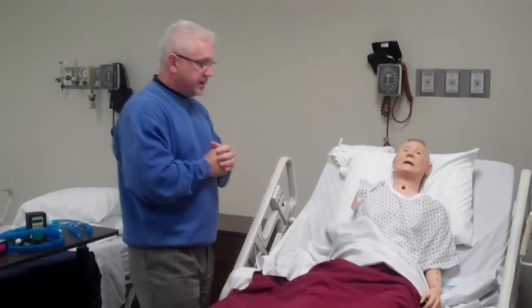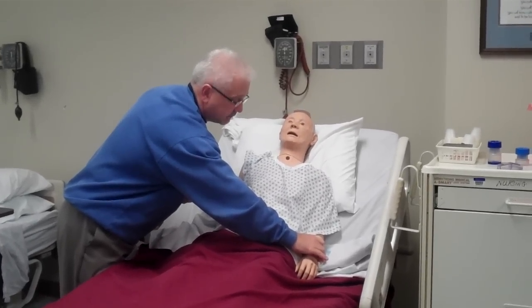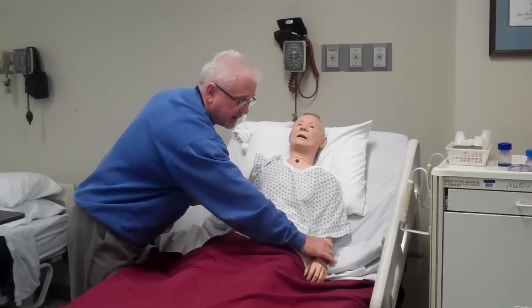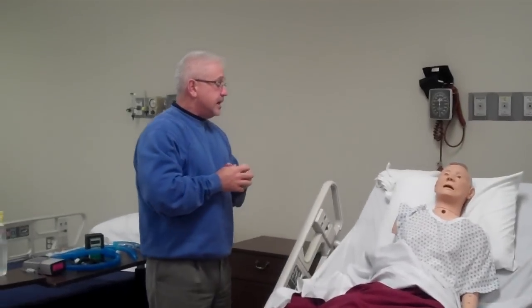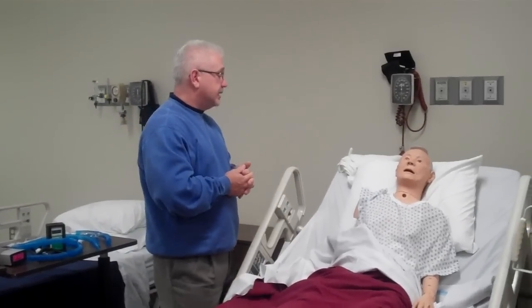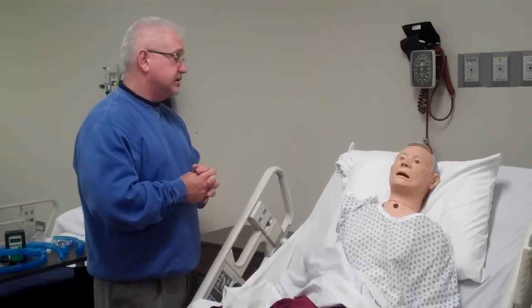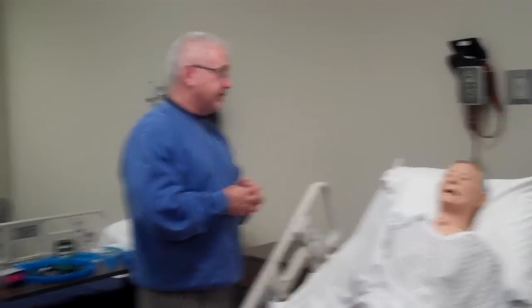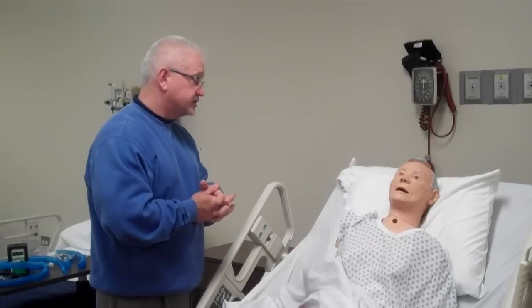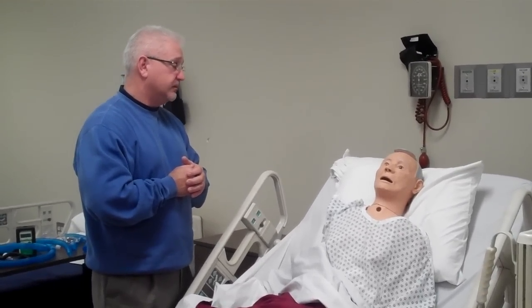I'd proceed to the patient's bed and the first thing I would do is check the patient ID. I'd look at their ID compared to what I already know: their medical record number, date of birth, and name. If they're able to speak, I might ask them that information. At that point, I would explain that I'll be placing them on some oxygen and ask if they've ever been on oxygen before. If not, I'd cover precautions: no smoking, no one in the room can smoke, no electronic devices, and any hand or facial lotions need to be approved by the nurse first. If at any time while wearing the oxygen they feel lightheaded, dizzy, or nauseous, they need to let the nurse know and I'll come back to check on them. Do you understand?